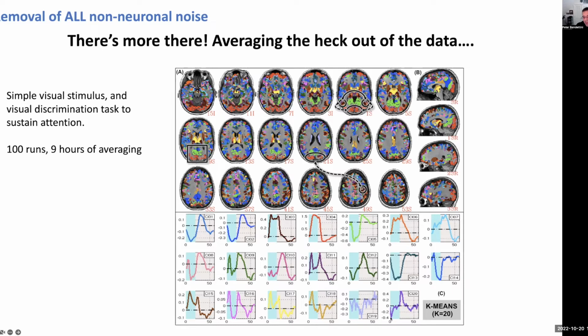They have transients that are negative at the beginning and high at the end that are probably real, that we always miss because, one, we don't have enough signal to noise to see them, and two, our models are not adaptable enough to pull them out. Whereas here, it was just relying on the time locked nature of it. You can see only a few of the responses look like this nice standard response, whereas a lot of them are completely all over the place. And it really is ordered. It's not like it's a salt and pepper. There's an order to the responses as well.